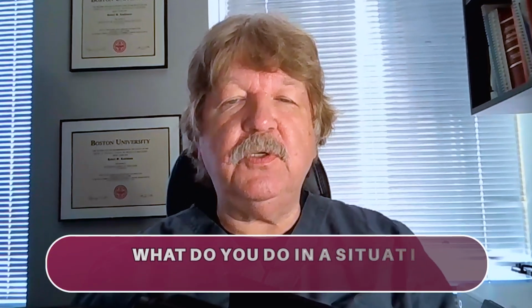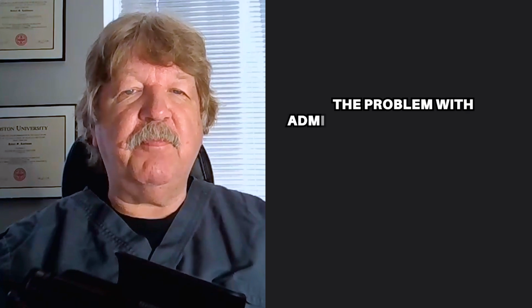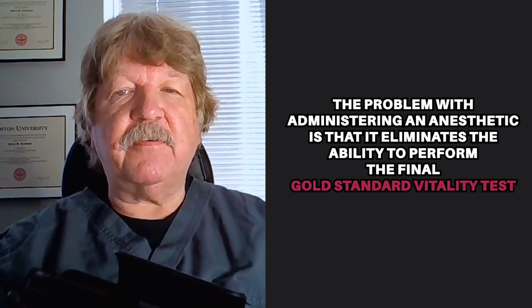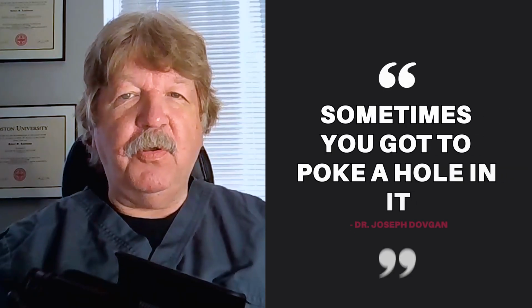If you're totally confident in your diagnosis, administration of local anesthetic is indicated, and you perform whatever treatment is necessary to get the patient comfortable. But what do you do in a situation where the diagnosis is not so clear-cut? The problem with administering an anesthetic is that it eliminates the ability to perform the final gold standard vitality test, the cavity test. As my late endodontist friend Dr. Joseph Dovgan used to say, sometimes you got to poke a hole in it.